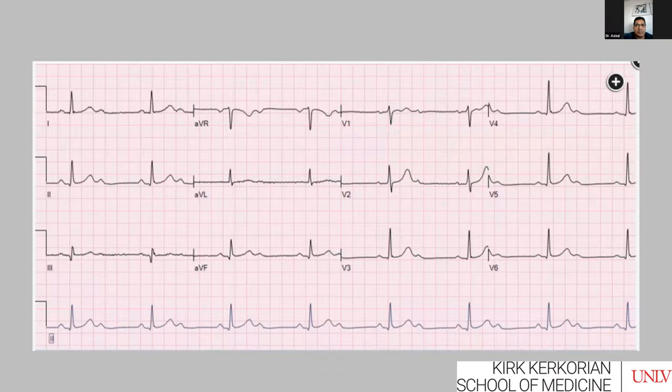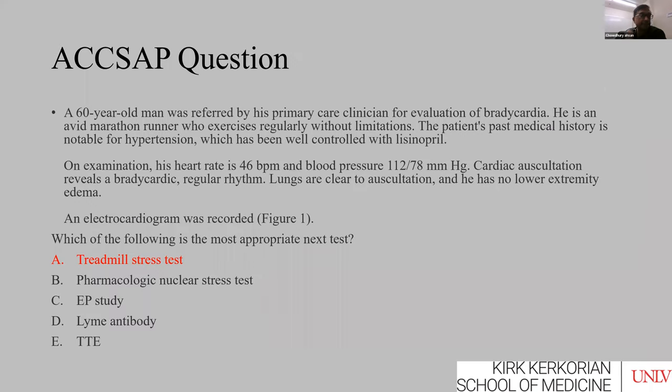Only problem, Hafiz, is that number D choice will be invalid for Bangladesh. So board expects that we do the treadmill, that no imaging, because ST segment is readable, and the goal here is to see that the conduction system is all right. You don't need to worry about this 2-to-1. It's most likely not infranodal. So that was the answer. Okay, Hafiz, that's the problem.